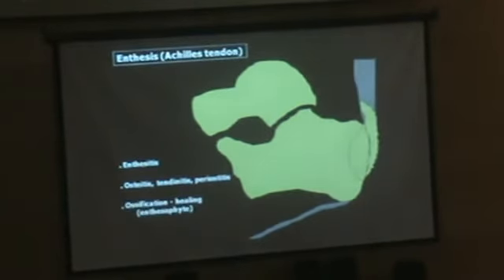And as part of the healing process, we have production of bone in the form of ossification, and we're going to see that often in chronic stages of disease, and this is what we call the enthesophyte. This is what we see, and this is part of the healing process. You know that hyperostosis is a very common feature in spondyloarthropathies, and we're going to see that in some examples.